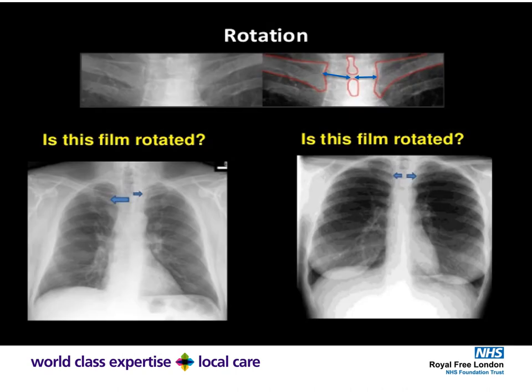Looking at rotation: on an unrotated film, the distances between the thoracic vertebrae and the clavicular heads are equal on both sides. On the bottom two films there is rotation, as shown by the difference in length of the arrows on each side.